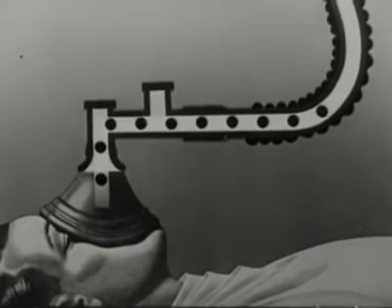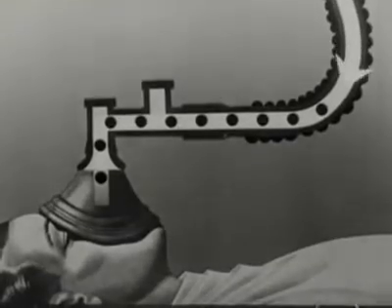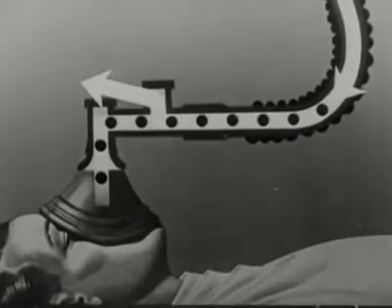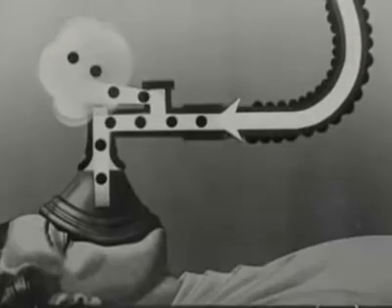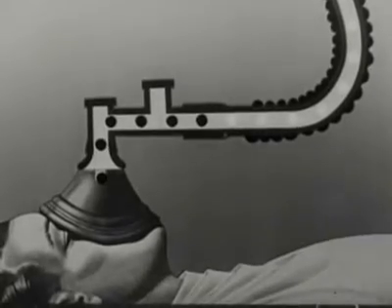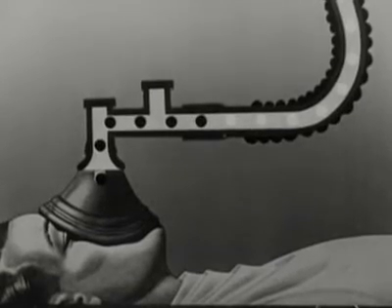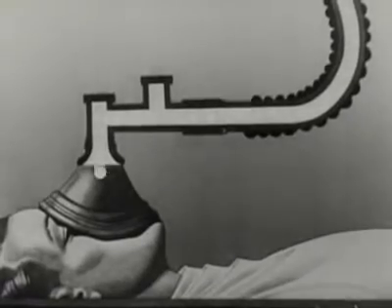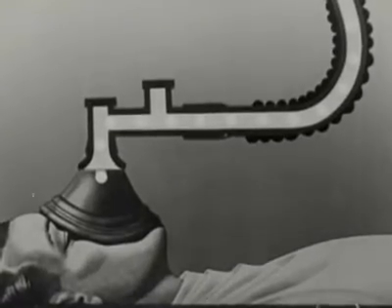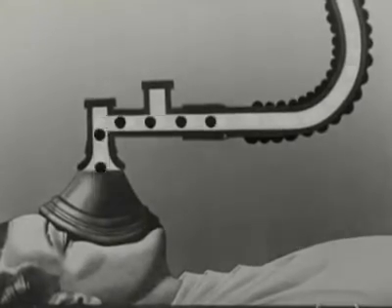At the same time, and during the pause before inspiration starts, fresh gases from the machine are coming down the hose, pushing still more of the exhaled gases before them through the valve. When the patient starts to breathe in, there is about 1/4 of the expired gases still left in the hose, and he will inhale these together with the fresh gases from the bag. Now let's see the whole cycle again.